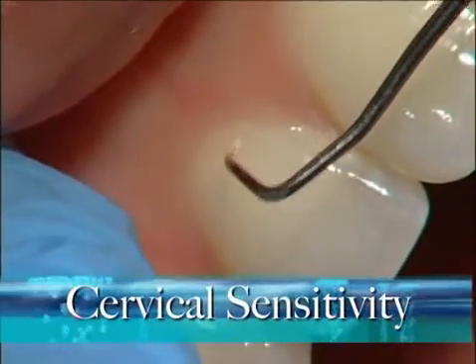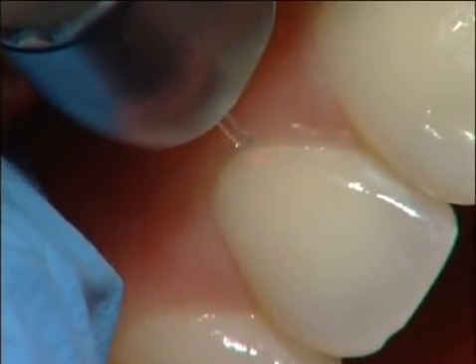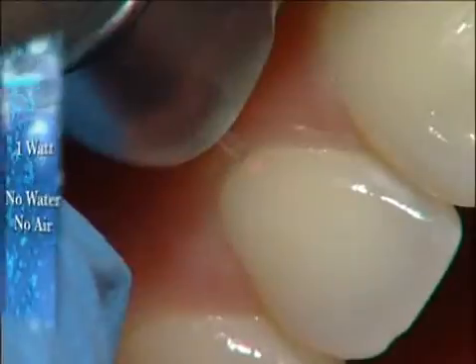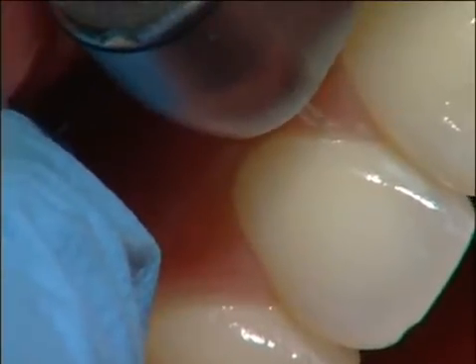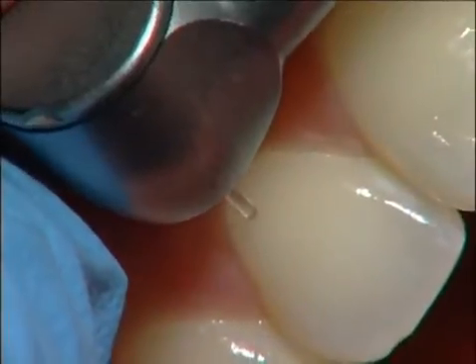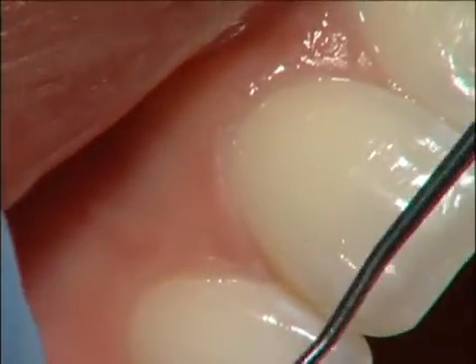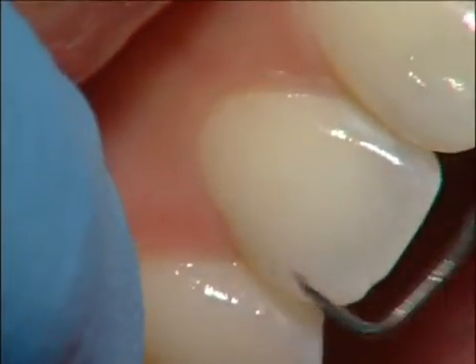So a number of our patients are sensitive at the cervical junction. You take your explorer, find where the sensitive area is, and we're going to take the MD at 0.1 watt, air off, water off, slowly circle the sensitive area for 30 seconds, 2 to 3 millimeters away from the surface of the tooth. At the end of 30 seconds, take your explorer, check the adjacent tooth first, then come to the sensitive tooth, check and see whether or not the sensitivity is gone. In most cases, the sensitivity will be gone in one pass. If it's not, repeat the procedure. Again, 0.1 watt, air off, and water off for 30 seconds.